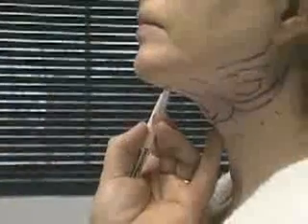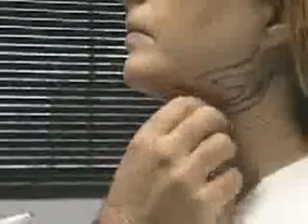all that out. I'll make two little incisions on the bottom of the chin that are very, very small, no bigger than these little marks that I'm making. And that way we can kind of crisscross and come at this in two different planes. Get rid of this flabby look that she doesn't like.